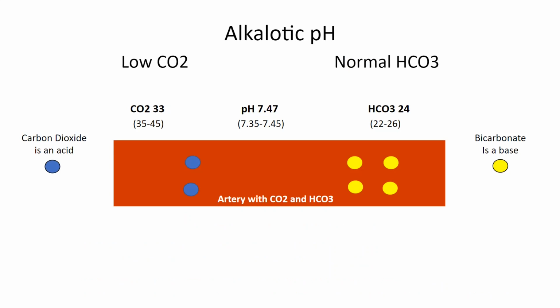Let's look at alkalosis. Please pull out the 3 basic ABG evaluation steps to determine the cause. Here, the pH is high, and you can see that there is more bicarb, HCO3, than CO2, and you can see this is alkalosis. Now let's go through it.